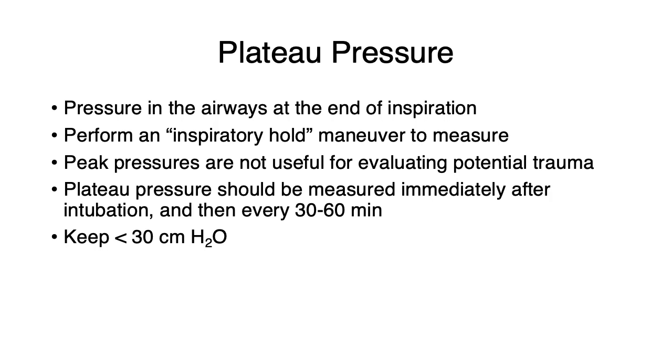So the peak pressures are not very helpful because biting on the tube or parts of the circuit can really change the peak pressure without actually giving us an idea of what the alveoli see. So the plateau pressure is the measure we go for.